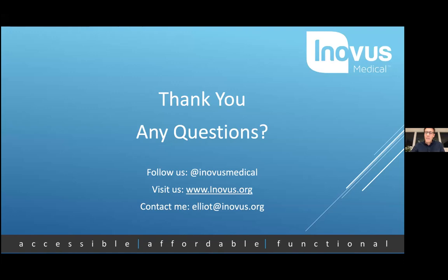Thank you, Comrade. So I mentioned when we were going through that at the moment you can benchmark your average score against all of the users in the platform, because we've got still a relatively small number of users and a relatively small number of data sets, given this has been going since July. But the answer to that is yes. As we get enough users, not only will we benchmark and so show that this is the score that you should get if you're an expert user and how do you compare against the expert user, but we will show the average score you should be attaining for the number of years of surgical training that you're in. So that allows you to benchmark against the mean scores of different grades. And then, of course, you're able to benchmark against your own performance and see how your performance is changing over time.